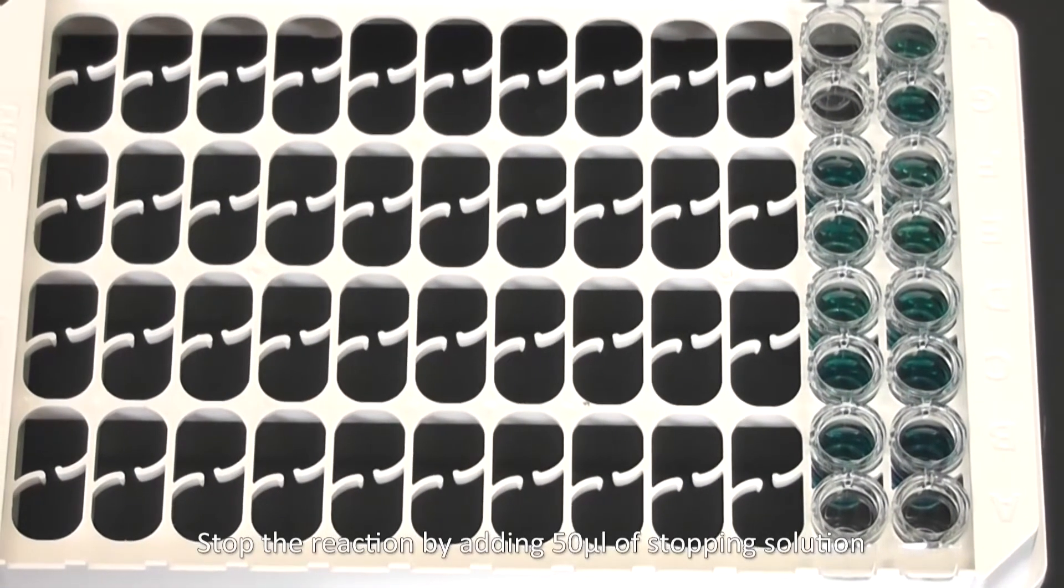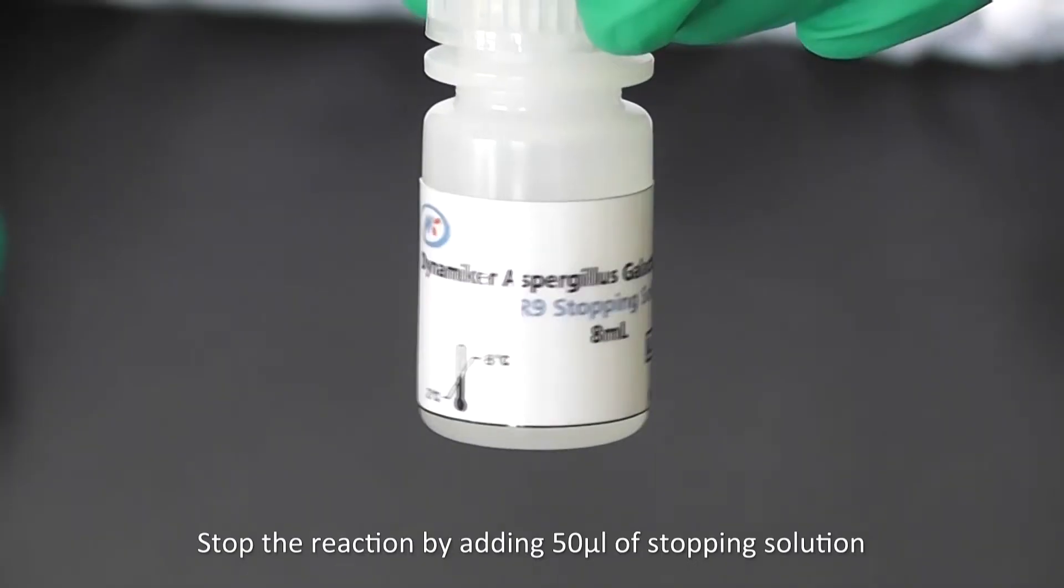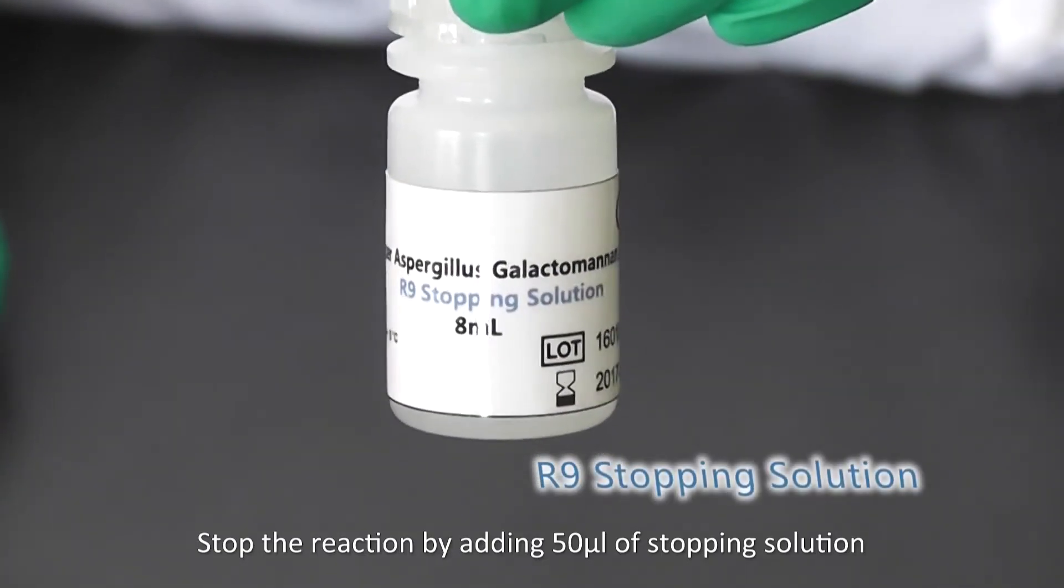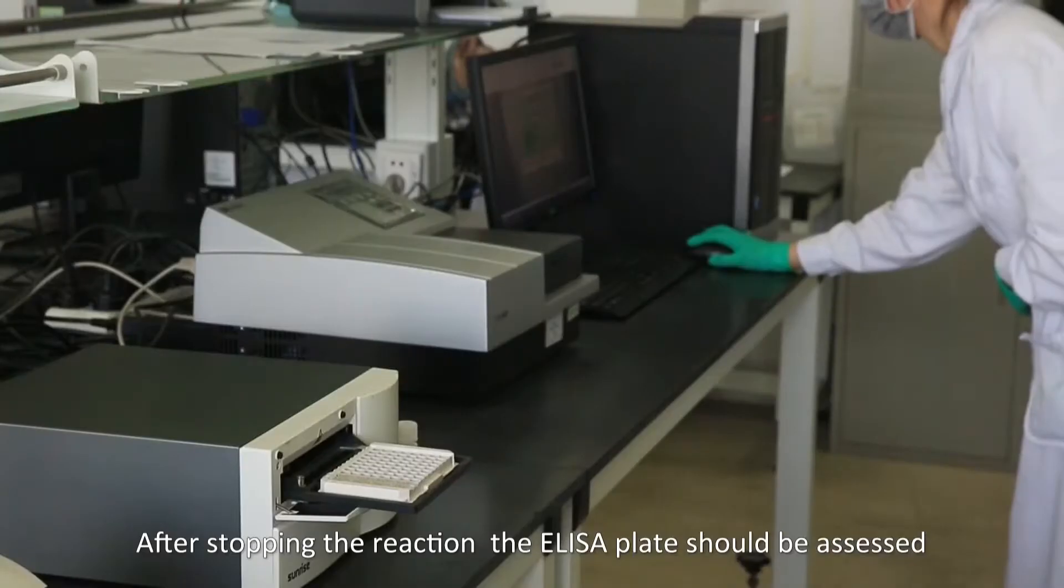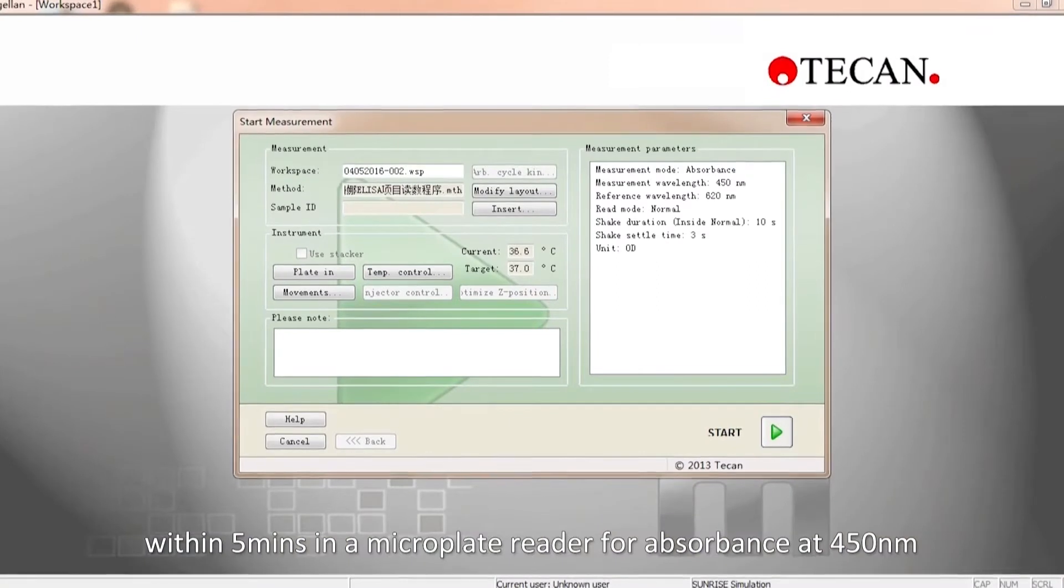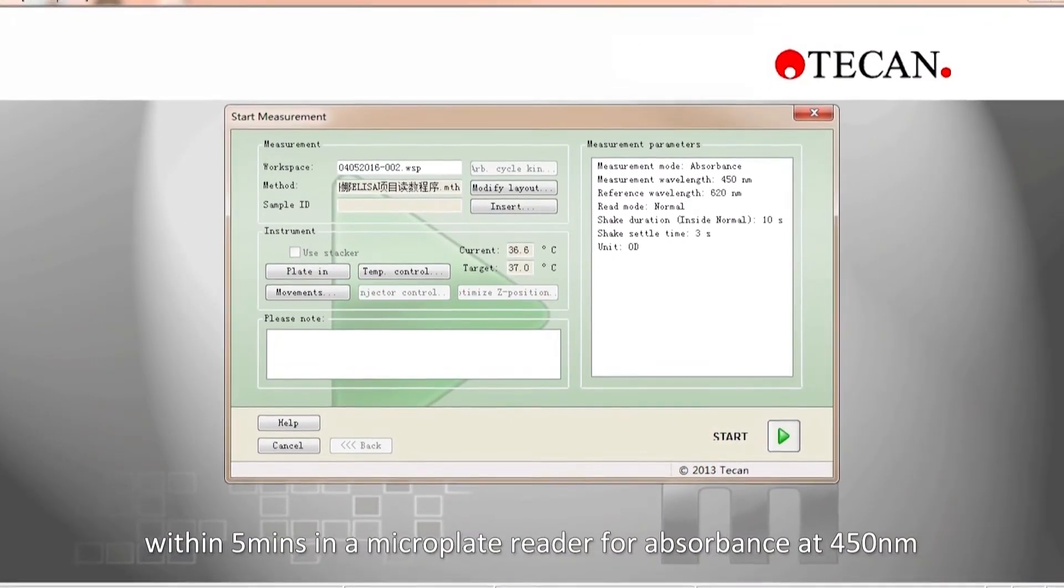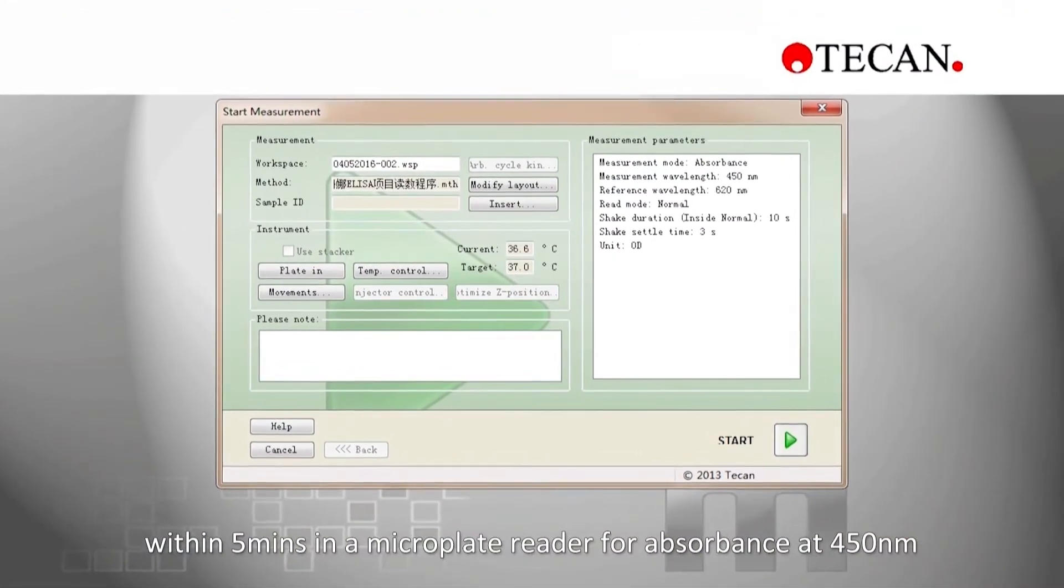Stop the reaction by adding 50 microliters of stopping solution. After stopping the reaction, the ELISA plate should be assessed within 5 minutes in the microplate reader for absorbance at 450 nanometers.